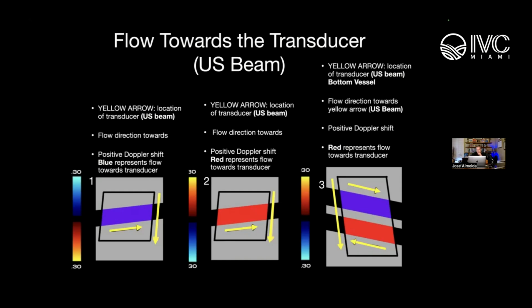So when you steer the box and you've got the yellow line pointing down outside the box, if you follow it with your finger and that line stays outside the box, that's what we call towards the transducer, or where the transducer side is.